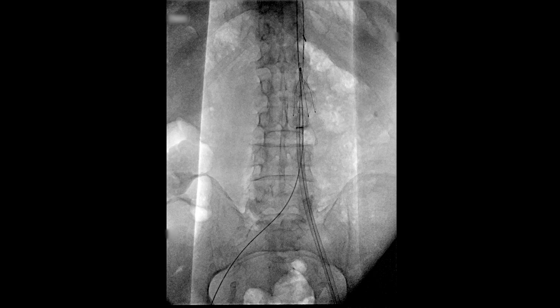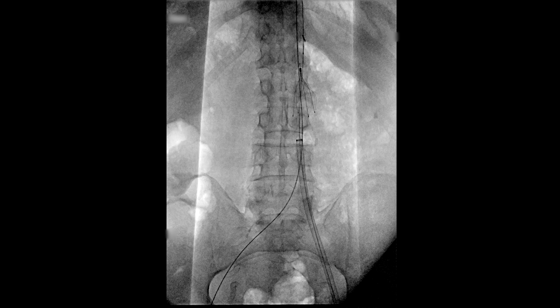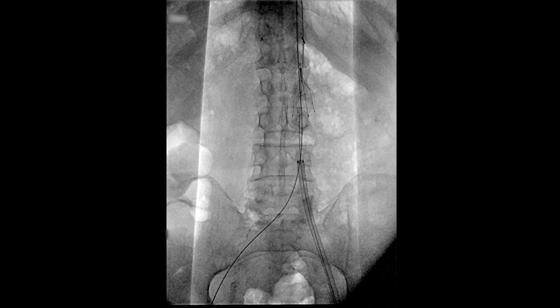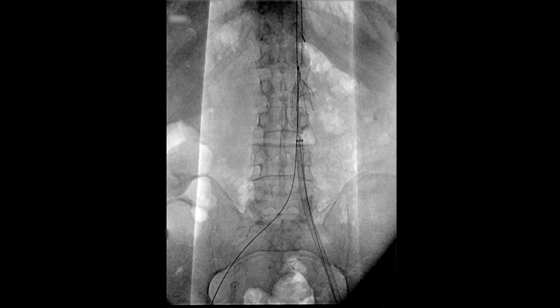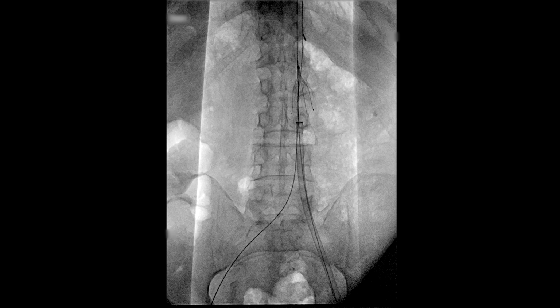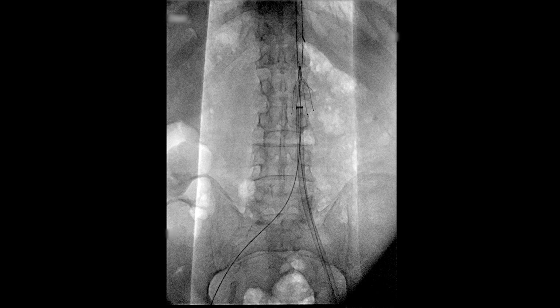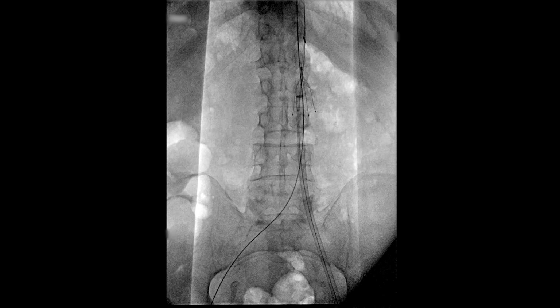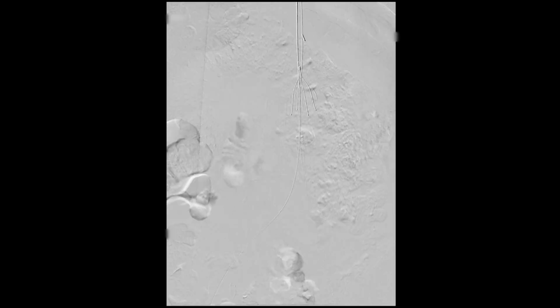Thrombectomy within the filter, slowly working our way up and down the inferior vena cava and aspirating rapidly as we move throughout the deep veins. We then perform one more thrombectomy throughout the lower inferior vena cava as well as the iliac veins. And once this is completed, repeat again in the inferior vena cava filter to try and extract as much of the chronic thrombus as possible.